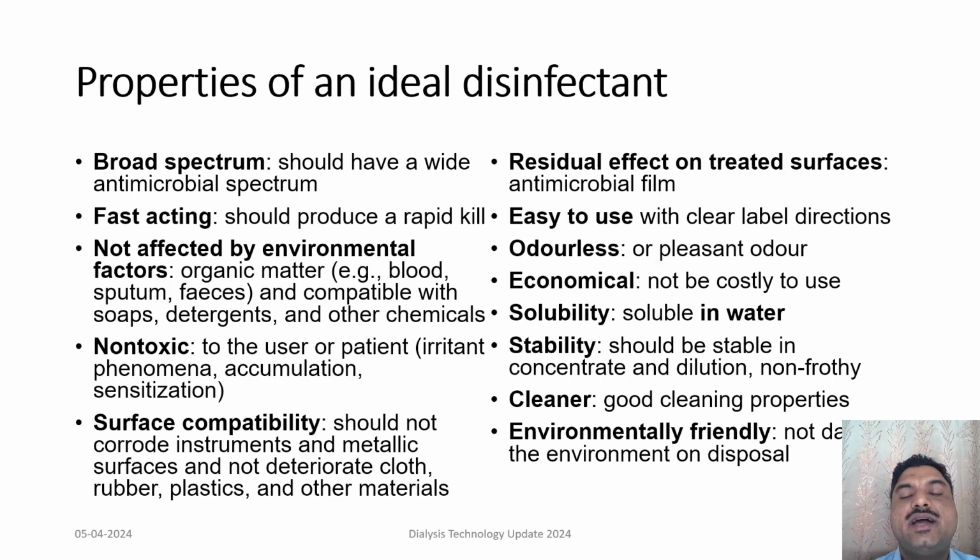So when we say a disinfectant, one would try to have an ideal disinfectant. An ideal disinfectant should be broad spectrum, that is, acting on various spectra of antimicrobials, should be fast acting, killing microbes rapidly, should not be affected by environmental factors like any organic material, and should be compatible with soaps, detergents and other chemicals.